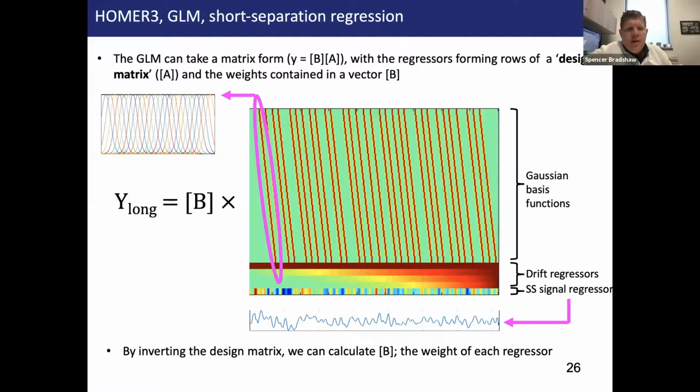Okay. And can Homer do a GLM where you would then become more complex and include multiple channels and make it more like a matrix than just a vector? I mean, that's getting into an image reconstruction analysis. So Homer is really doing channel-wise analysis.